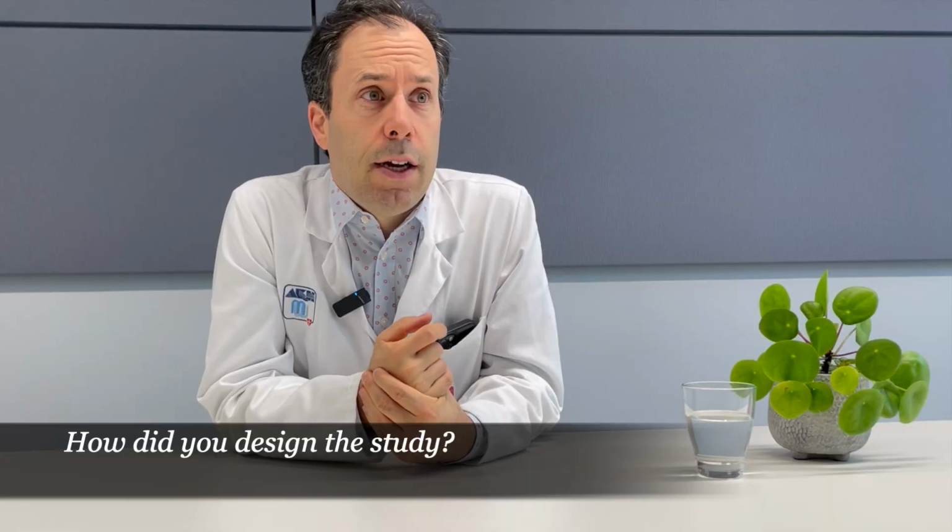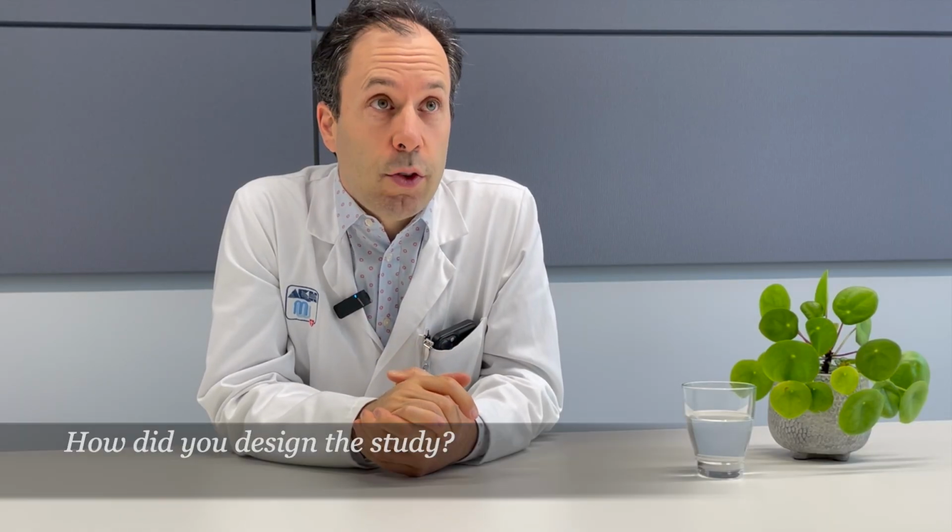At baseline, the patients received the nuclear tracer, and we measured the uptake in the lungs, basically how active the fibroblast-driven scarring process is. And then we tracked patients over 2 years to see who progressed and compared that with their baseline scans.